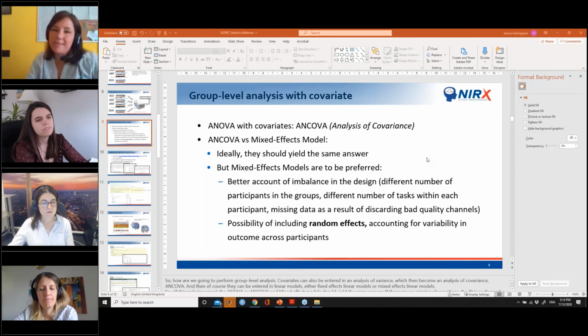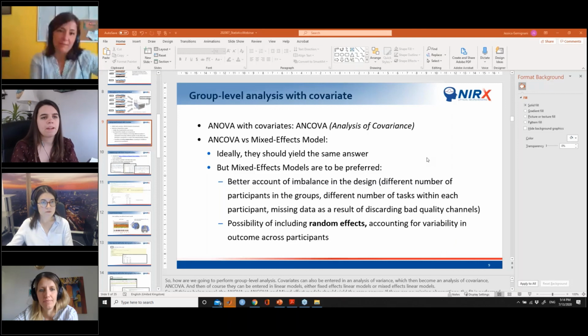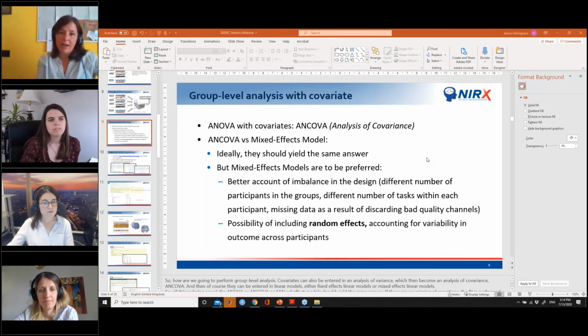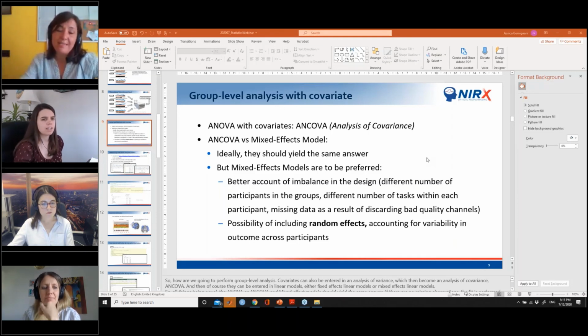Before knowing the age range, I would have said that since it is already taken into account in the grouping, the age wouldn't make much of a difference. But 20 years is quite long, so maybe there is an effect.